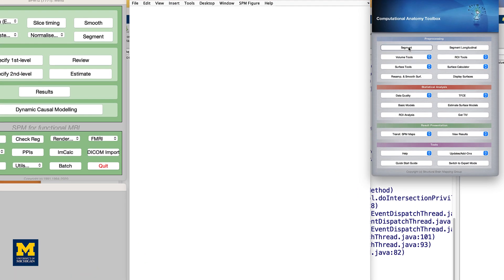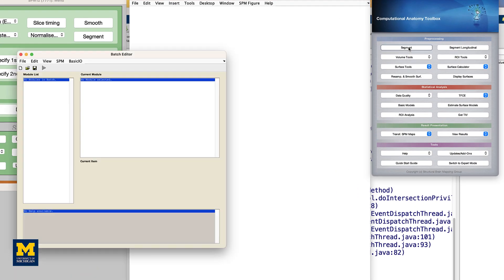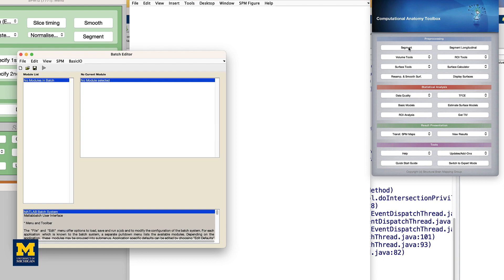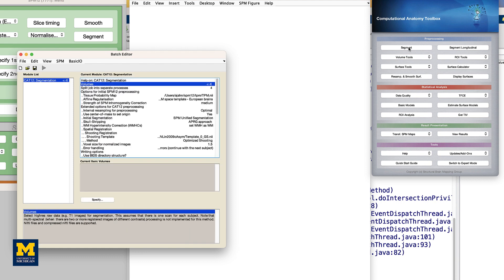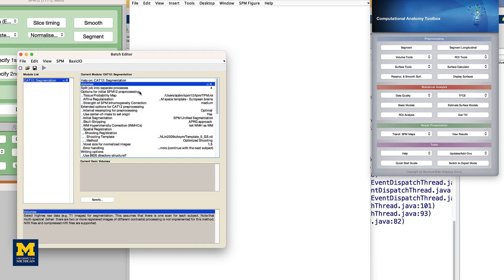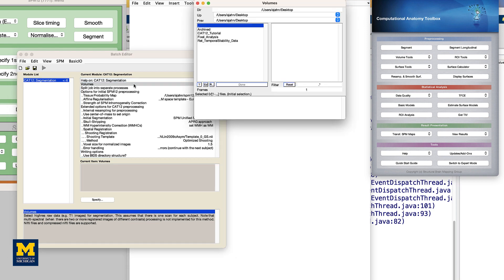This will open a new batch editor window. As you recall from the SPM12 tutorials, an X indicates the fields that need to be filled in before the module can be run.